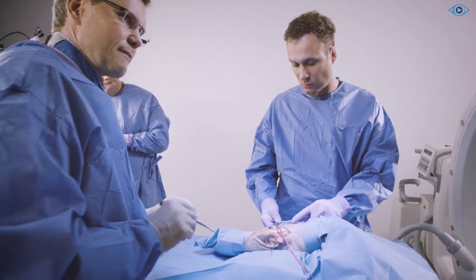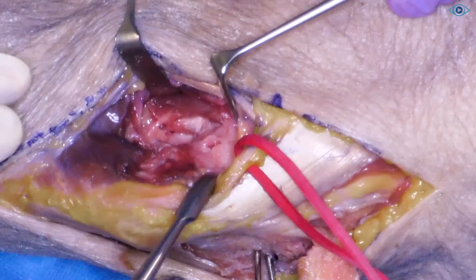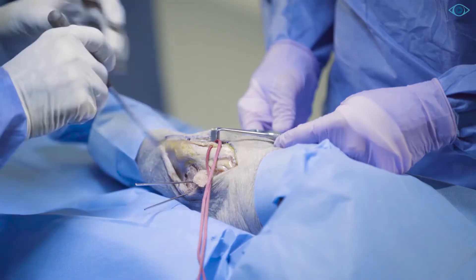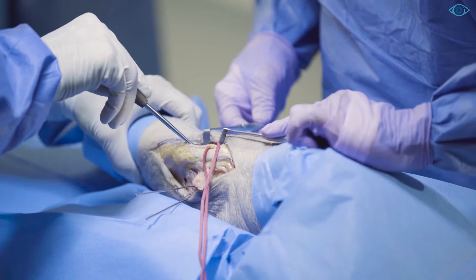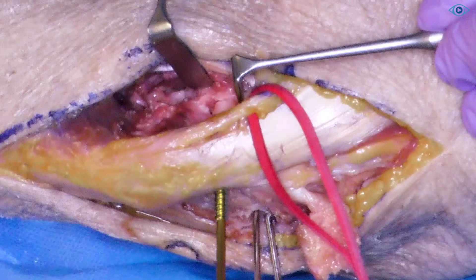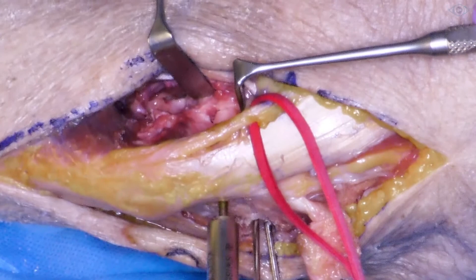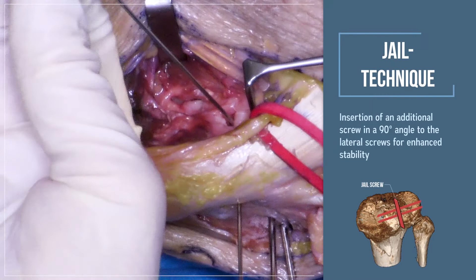In the x-ray, we just saw something very typical. The tibial head remains a bit too wide after the provisional reduction. We can see the gap here in the back. Also, the fragment is still not repositioned completely. We will now elevate this a little to fine adjust it. Then we are going to try and reduce the fracture with ligamentotaxis. We are going to use a tension screw here to compress the tibial head, especially posterolateral. The K wire is directly in front of the biceps tendon, at the same height as the front edge of the fibula head. From posterolateral, the screw is now inserted in jail technique to further support this posterolateral fragment.